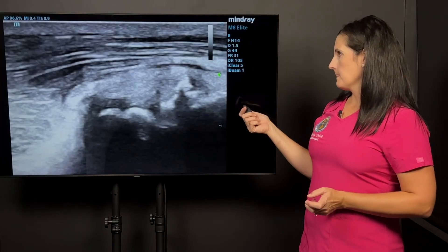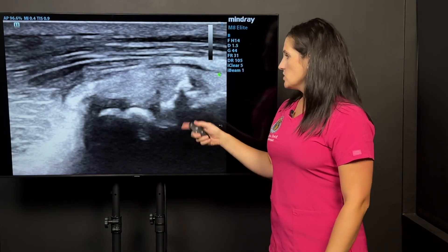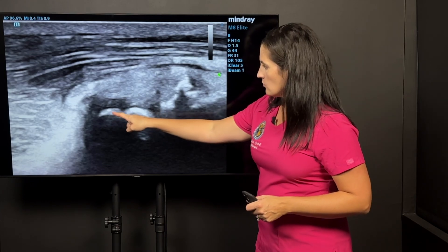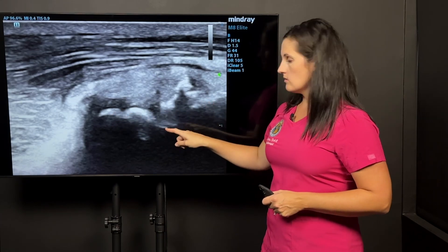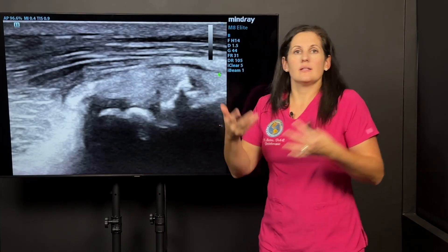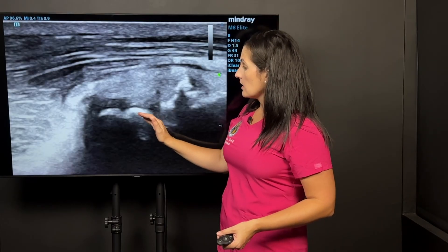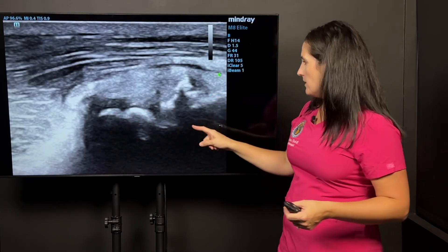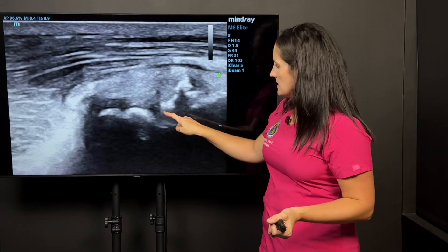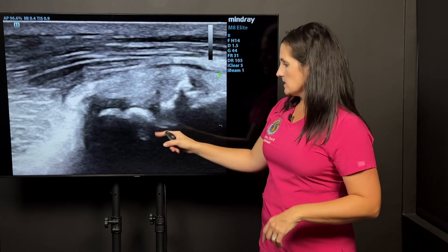It's actually an unstable joint. I have a little bias towards ultrasound — I love it — so I did an ultrasound as well. These are his bones that make up that CMC joint. Typically, if I had ultrasounded someone who was 20 and didn't have any arthritis, we'd see more clearly defined white lines of these bones. But with arthritis, you see what I call 'jaggedy' — that's not a medical term — but jaggedy cortical irregularity, changes in the bone from arthritis. This is the joint space right there.